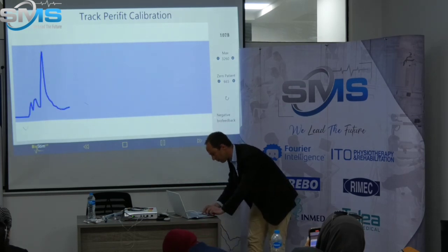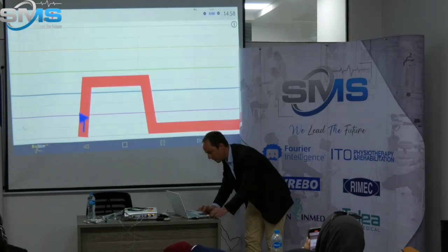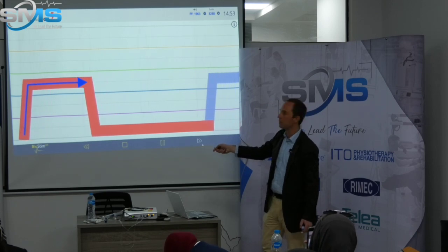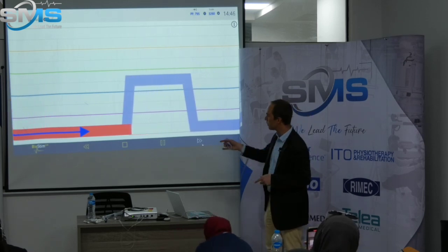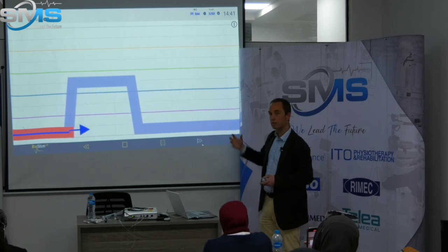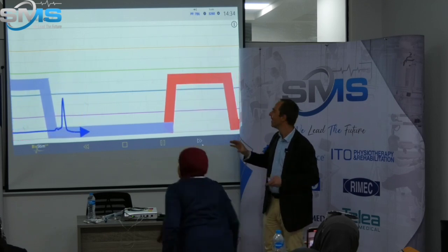If we start, so here, I cheated a little, but usually imagine we've got a flat line here. So when we start, here you see the red line. During the red line, we have stimulation. Okay, so that's first part. So she has felt something. And then we ask our patient, please try to contract the same muscle that has been activated by the device. First time, nothing. Maybe just a little glitch.